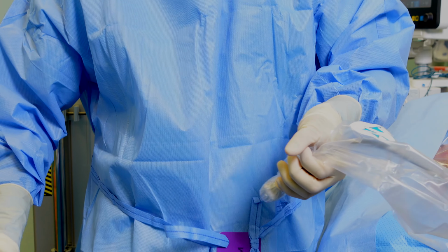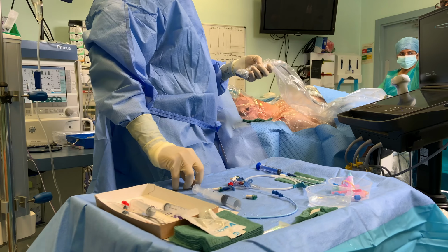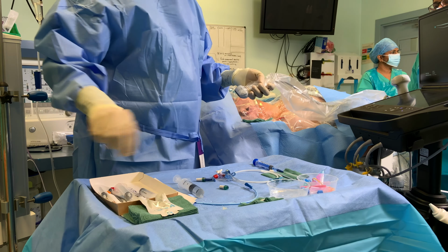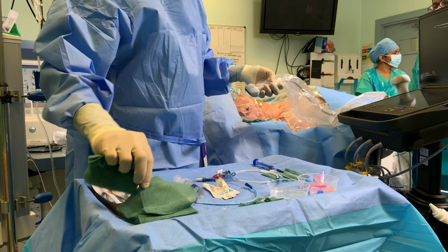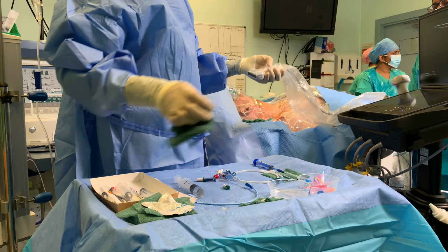Now what? Ergonomics. Think about where you want the ultrasound screen, whether it's behind the patient, in front of you. Think about how you position the patient, the bed or the trolley height. Are you going to sit or stand? And think about where your equipment is going to be. Then find the anatomical structure that you want.